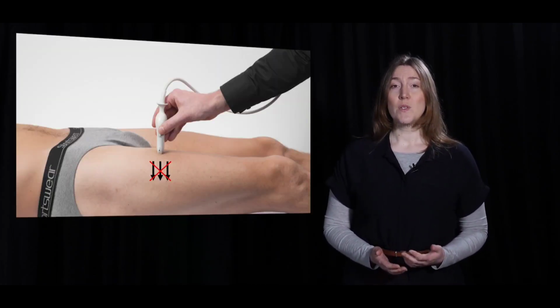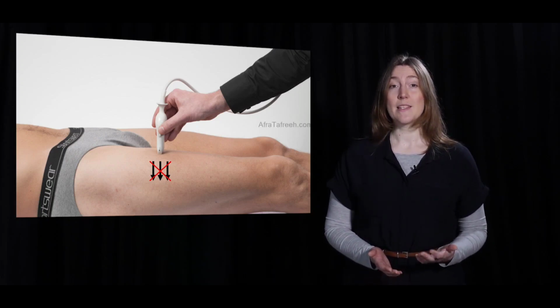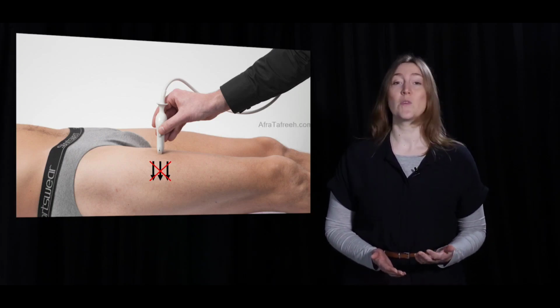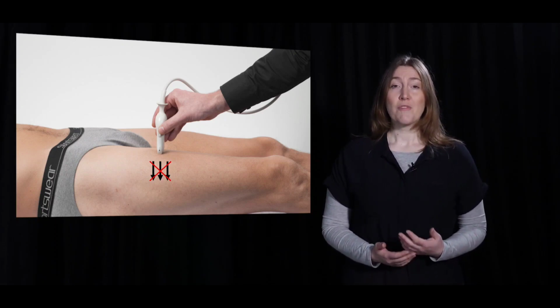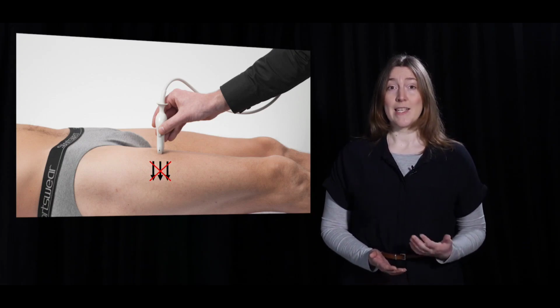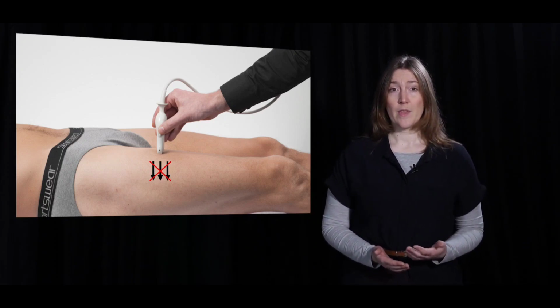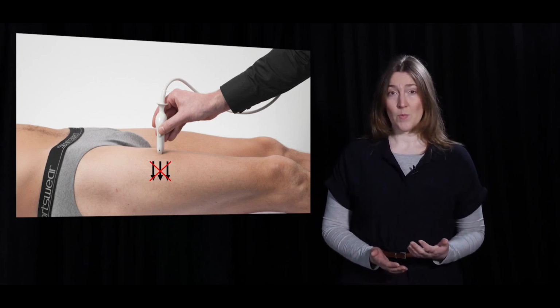The importance of reducing the pressure to avoid squeezing of bursae and capsules implies that muscle tension should also be avoided. The pressure of muscle contraction also leads to this squeezing of the aforementioned anatomical tissues. So make sure that your patients have a relaxed and comfortable position without activating any muscles when you're about to scan bursae and capsules.